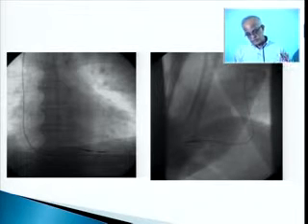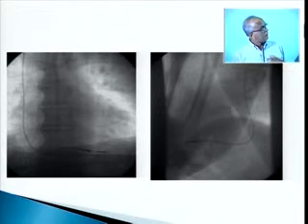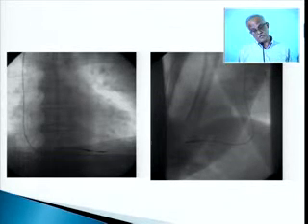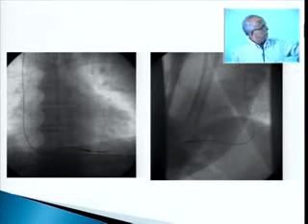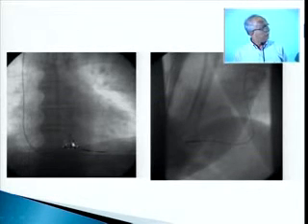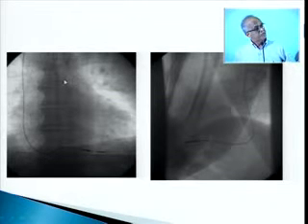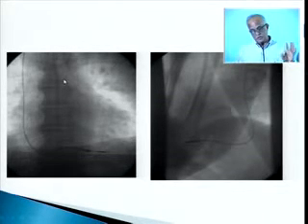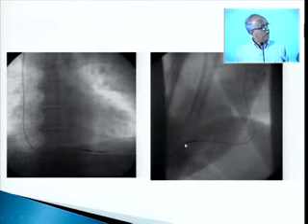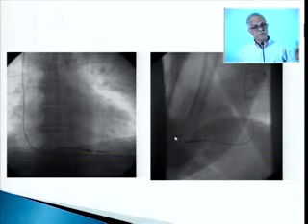This is the photograph of the lead. Generally, when we do permanent pacing, we do a subclavian vein puncture through which we put a lead into the right ventricular apex. So you see that the lead is in the right ventricular apex. In case we have dual chamber pacing, then we put another lead. It comes from above, and sits somewhere here in the right atrial appendage, and it moves in a semicircular pattern with each systole. So you can make sure that it is in the right atrium. And in a lateral view, you are sure that it is pointing anteriorly because the right ventricle is anterior.